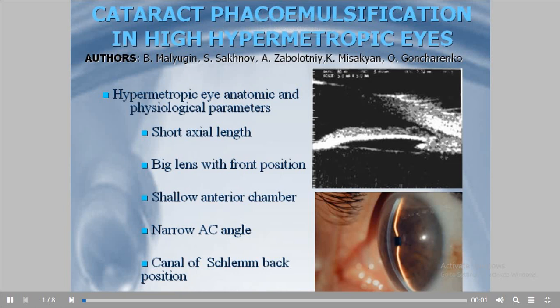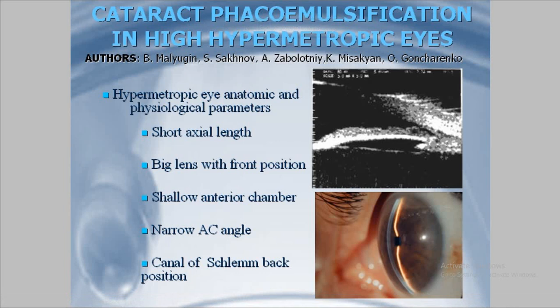Significant risk factors for incidence of intraoperative complications of cataract surgery with phacoemulsification. And with patients with these risk factors, further preparations and prophylactic measures are necessary. Thank you.